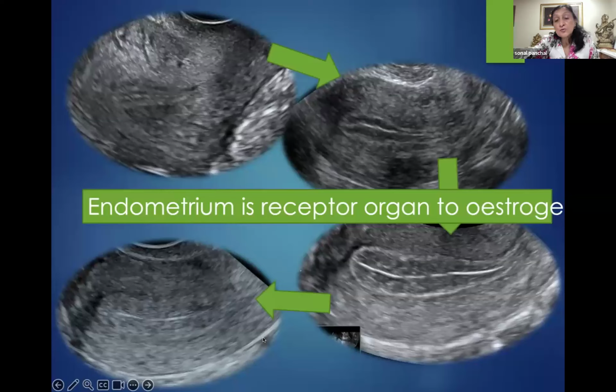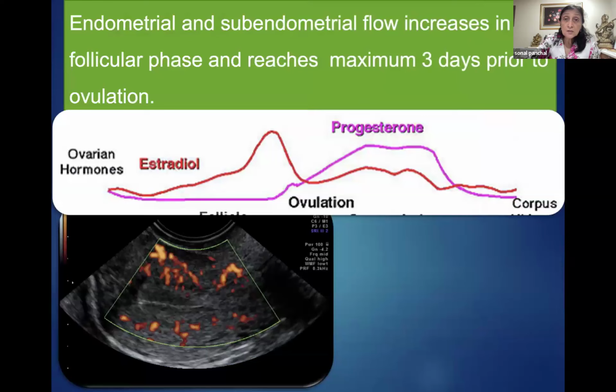Whereas if there are truly supraphysiological levels of estradiol, where there's either a PCO patient or it is IVF stimulation, that's where the endometrium will lose its multilayered pattern. It becomes homogeneous. But look at this. It is absolutely isoechoic to the normal myometrium, not hyperechoic. This is also a pure estrogen-dominated endometrium. All these three endometria are good for implantation provided the vascularity is good.